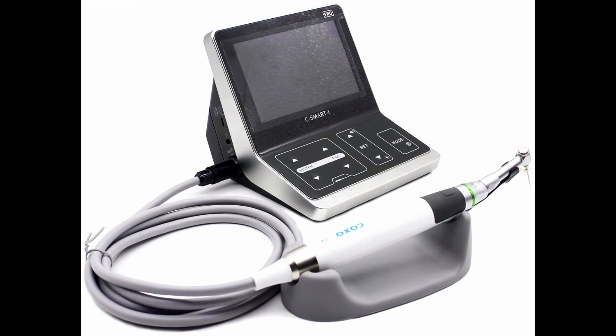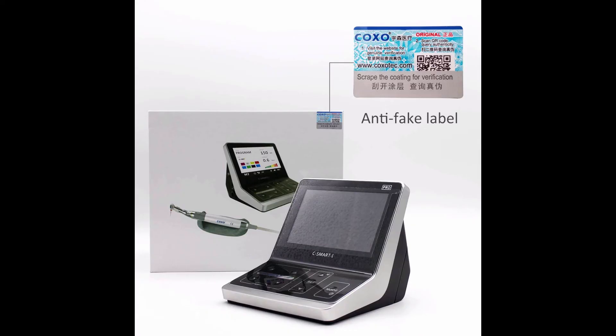COXO Soco C Smart One Pro Endo Motor with Apex Endodontic Motor. The products sold by Protector Dental Store have an anti-fake label on the packing box. You can check if the product is original from the COXO website. There are many fake and high-copy products online — please order from the formal store, Protector Dental Store.